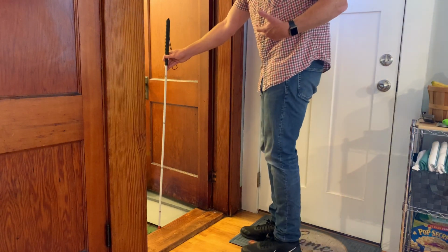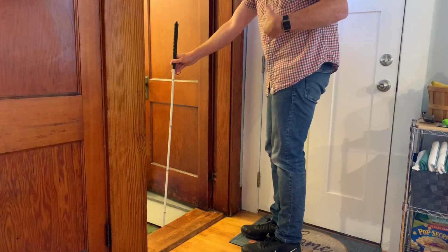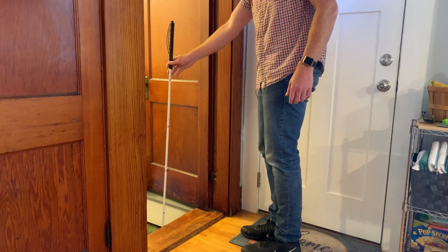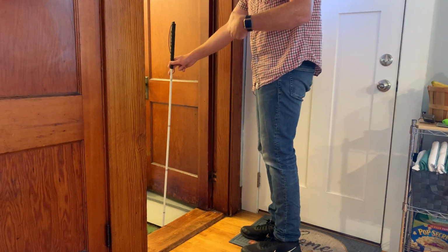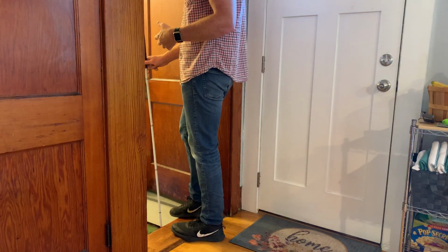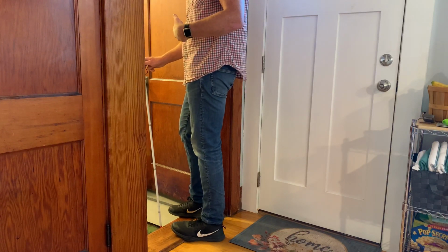My cane is resting against the edge of the stair, the corner where the first step and the landing intersect, and my cane is up vertical, straight up and down. I'm holding the cane in pencil grip, and now I know exactly where the edge of the stairs is, so I can start to approach it with my feet. I'm doing that now, walking up to my vertical cane until one of my feet finds the edge of the landing before the stairs start going down.